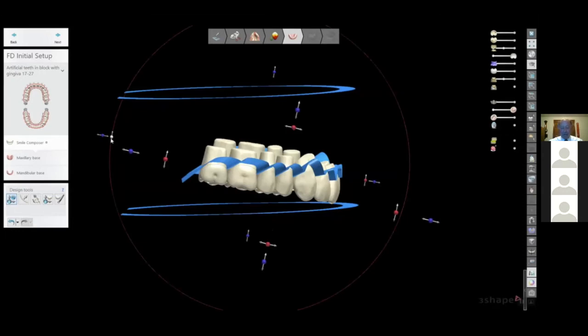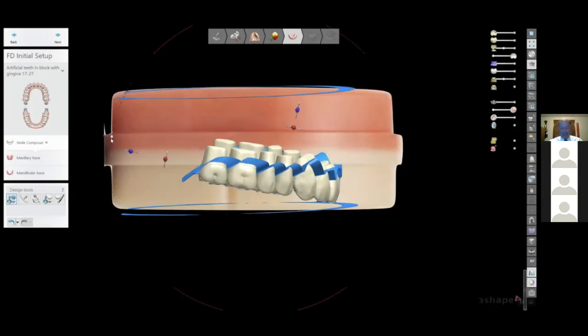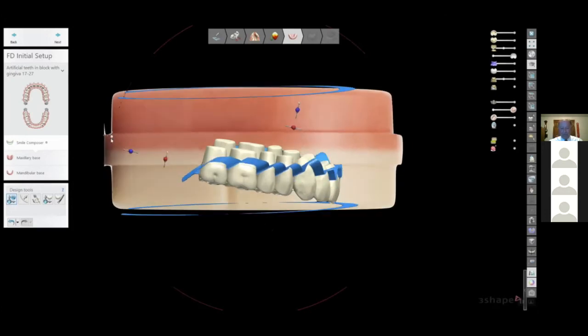And in looking at it in a profile, we could actually grab some different handles. We could kind of do some teeter-tottering here as well, making the lower length shorter and posterior length longer, et cetera. And again, putting the overlay here of the disc, you kind of get a little better idea of what we're doing with playing games here with positioning the teeth within this white and pink component of the disc.